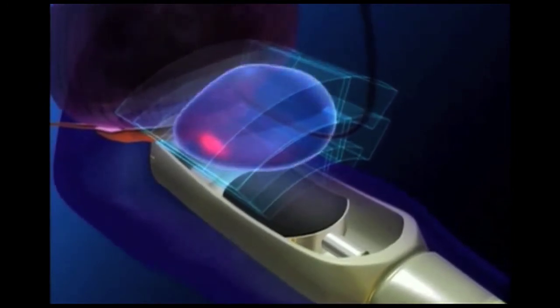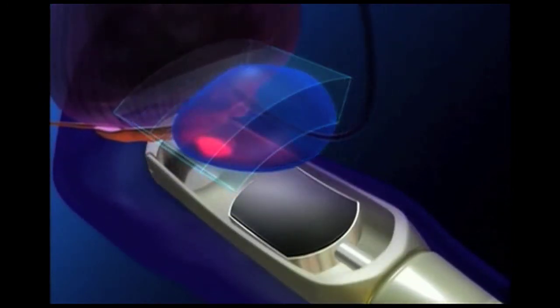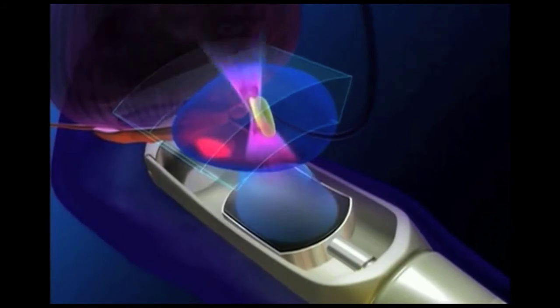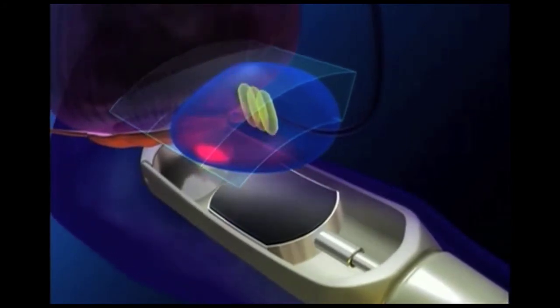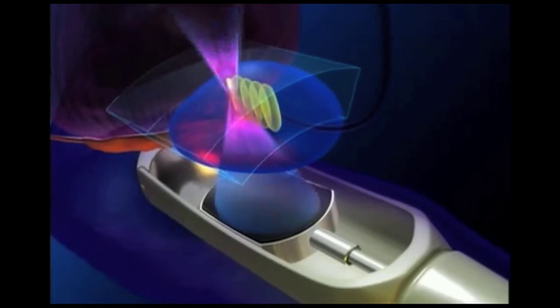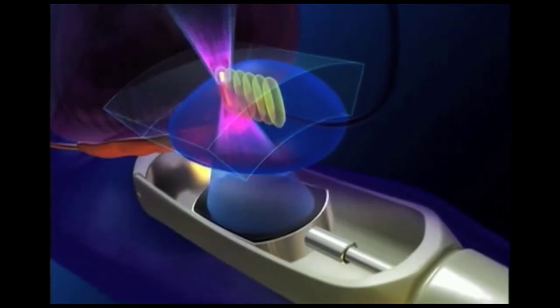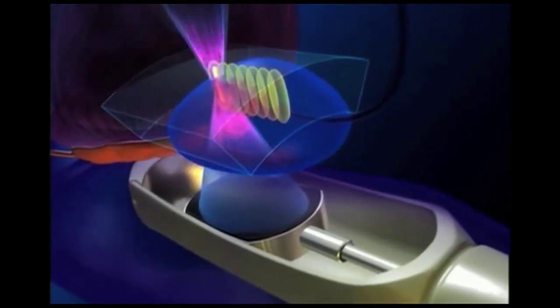All the treatment zones are pre-planned and checked by the physician prior to starting the HIFU treatment. The imaging capabilities of the technology allow for identification of vital structures such as the prostate capsule, seminal vesicles, rectal wall, and physiological location of the neurovascular bundles.